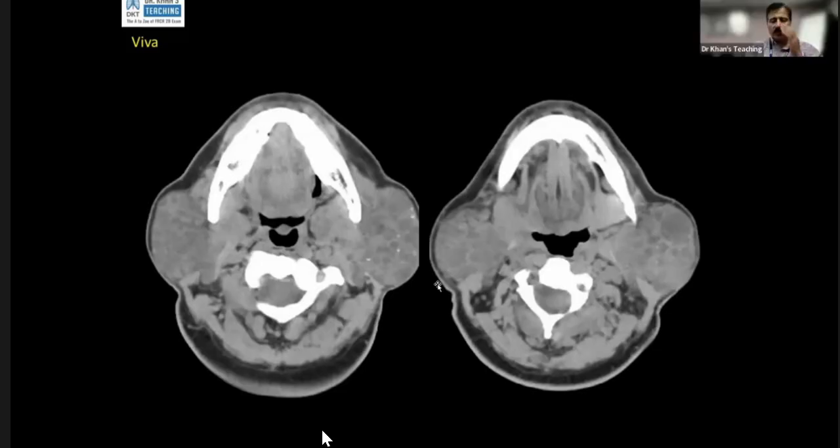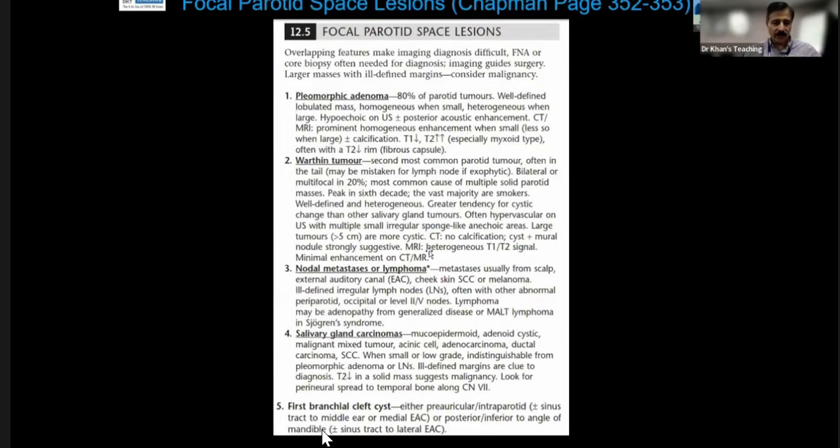That's fine. Well done. So what do you think has happened here? Pathologically speaking, what are you looking at here? Probably autoimmune parotitis, and multiple cysts are there, but I would like to ask the age of the patient. Okay, let me take over.